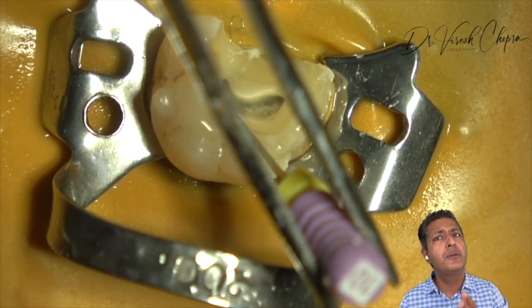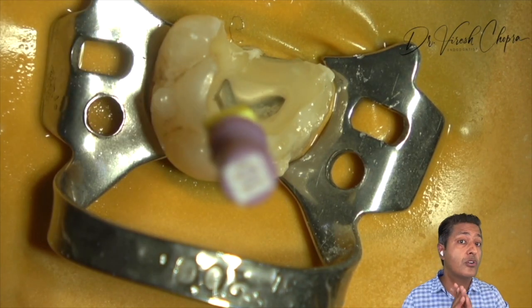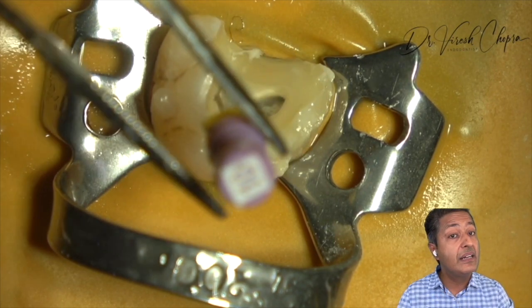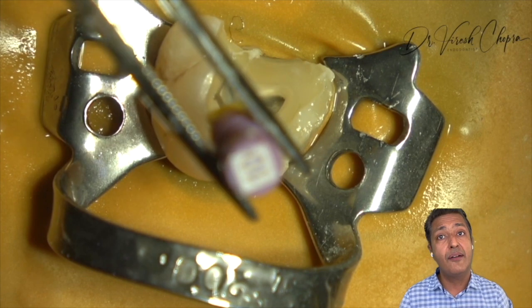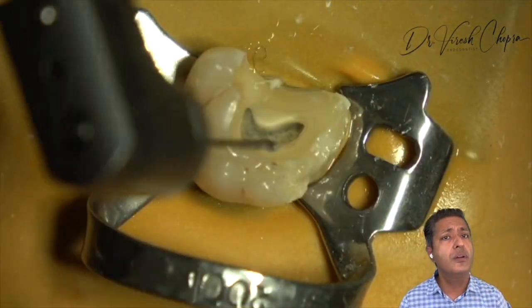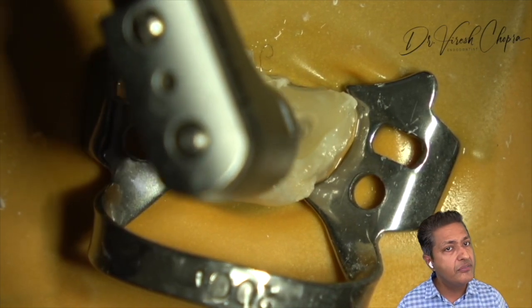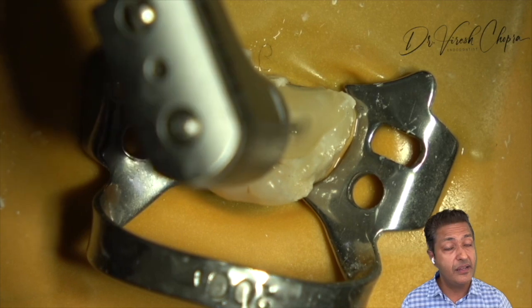So we have to be very gentle, introduce a 10K file and do not rotate the file completely inside the canal. We have to introduce the file by giving a quarter turn or doing a watch winding motion. But please, no active cutting to be done here.